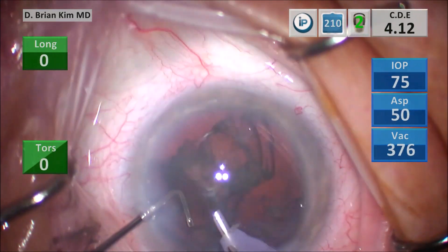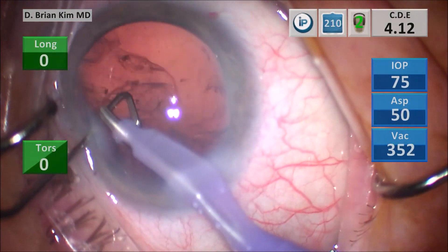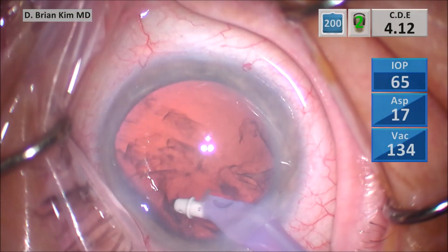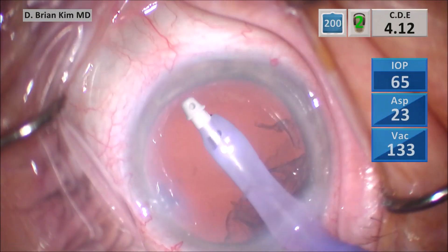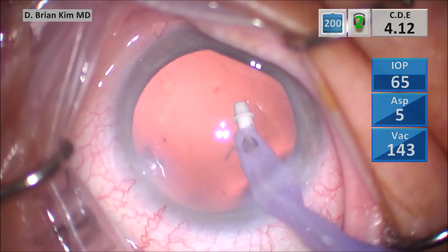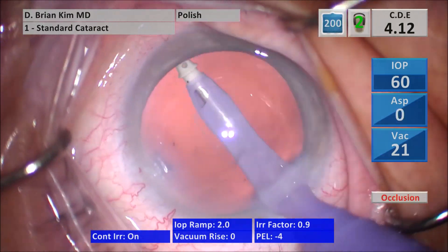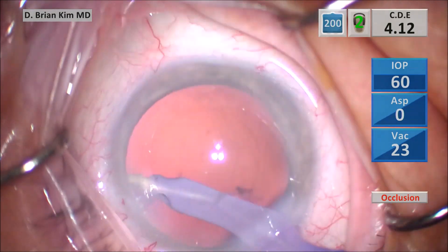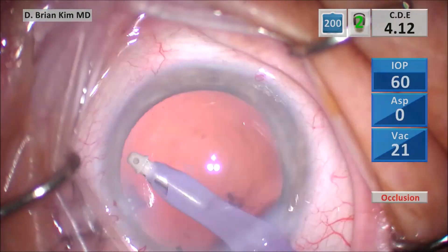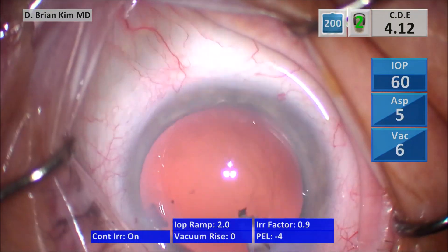You can see it tumbles out quite nicely and I always make sure that my chopper is deep so that it protects the posterior capsule. I'm pushing BSS while I remove the phacotip and then I switch to the I&A tip — this reduces flattening of the anterior chamber. I'm carefully removing the cortical material, though as you can see there was not that much cortical material in the bag. I'm switching to the polish mode, polishing underneath the anterior capsule surface to remove any cortical material and lens epithelial cells. There was a little piece of endonuclear material and it just went out of the eye quickly to evacuate it rather than trying to crush it with a cannula.